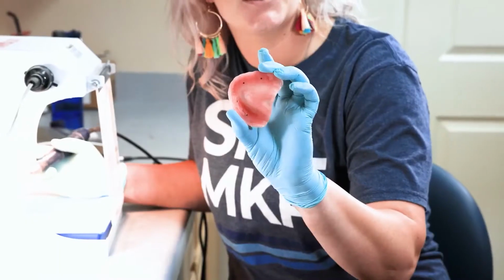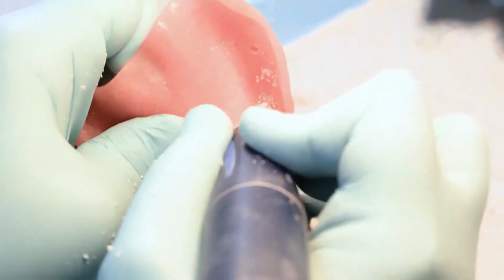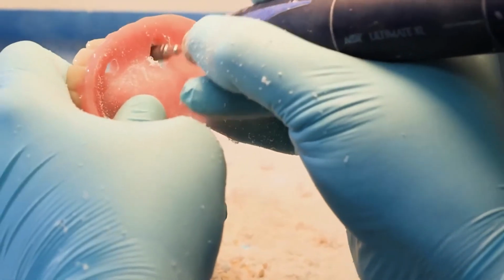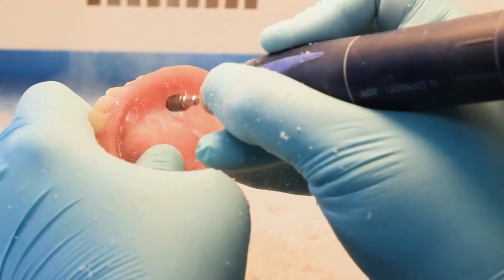Majority of the practices that place dental implants in this all-on-4 fashion use a temporary denture and then convert that denture the same day into a fixed prosthesis. Some of the cons that are associated with those temporaries are the fracture of the temporaries, and then you are on a very soft or liquid diet for the next 4 to 6 months.